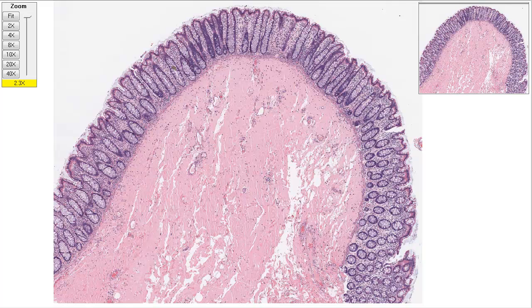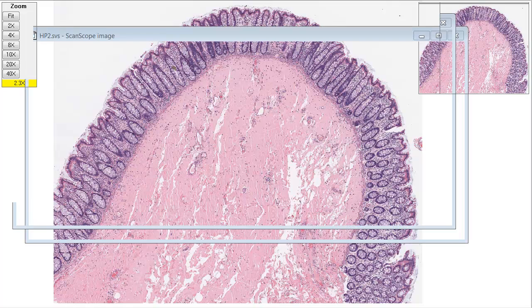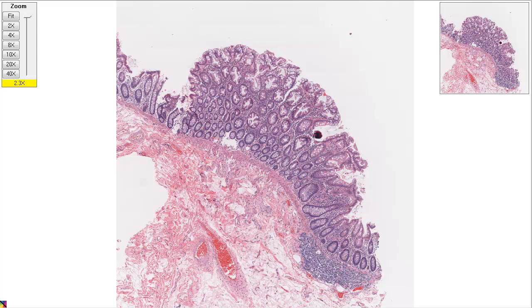So we left off last time looking at this piece here, which is normal colon. We had said this is an example of what you'd see at the edge of a specimen resected for colon cancer. Now I'm going to click to the next one, which is a slightly more worrisome area if you're a pathologist looking through the colon. And so I'm going to zoom in just a little bit here to take a look at these.